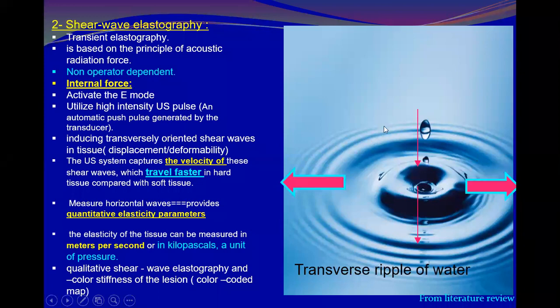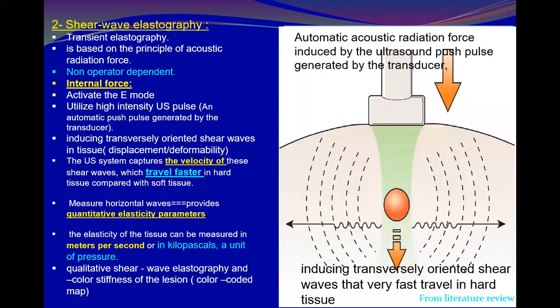This is the same as shear wave elastography. An acoustic radiation force, or high intensity ultrasound pulse, is generated by the transducer when you activate the E mode.